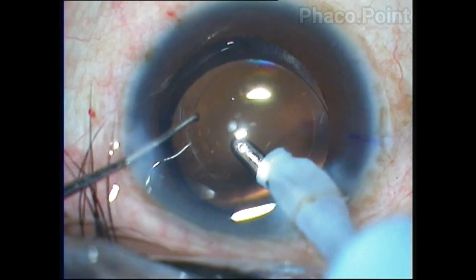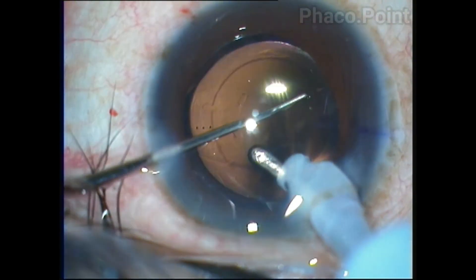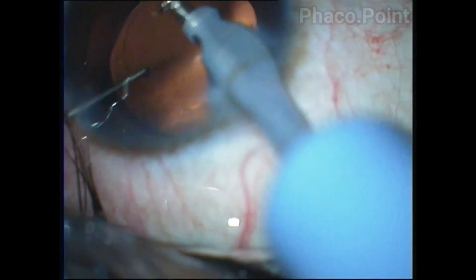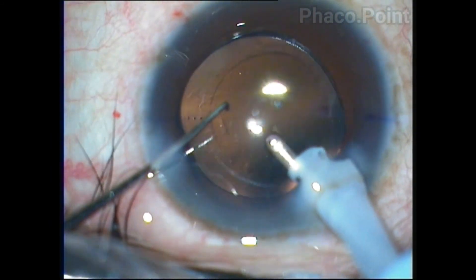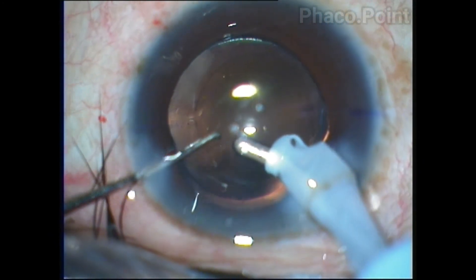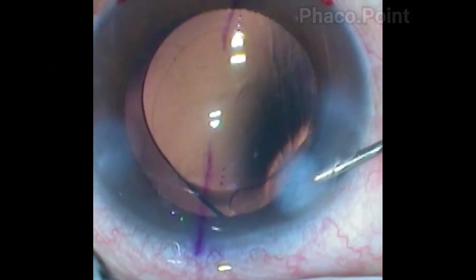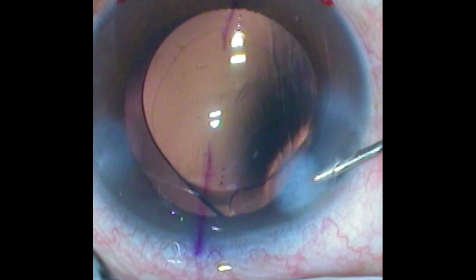The final placement is then achieved. Two things are important here: first, make sure that the Purkinje reflexes from the cornea and the lens are well centered, along with the marks of the cornea and the toric marks on the lens. The advantage of having radial toric marking is that you can verify the placement by parallax — if the radial marks on the cornea and the toric marks on the intraocular lens are perfectly parallel to each other, it means the positioning of the lens is spot on and it is on the right axis.